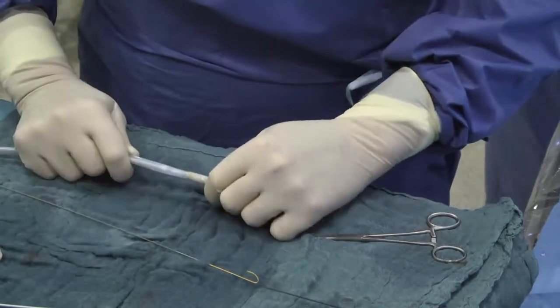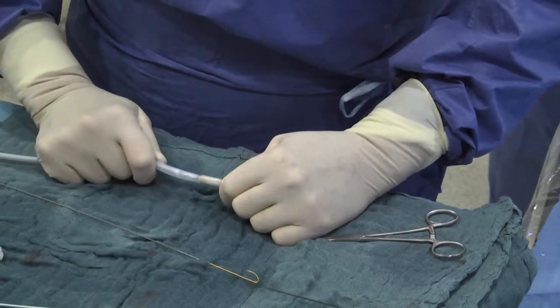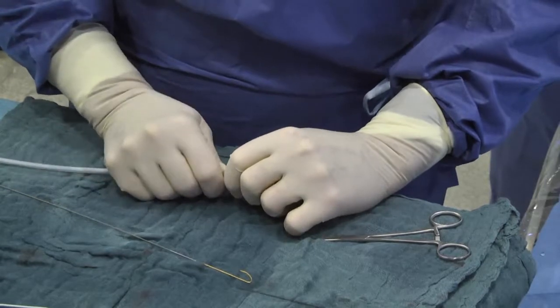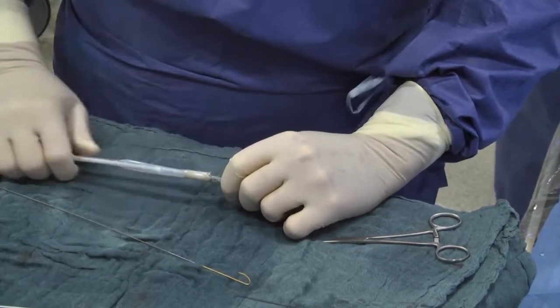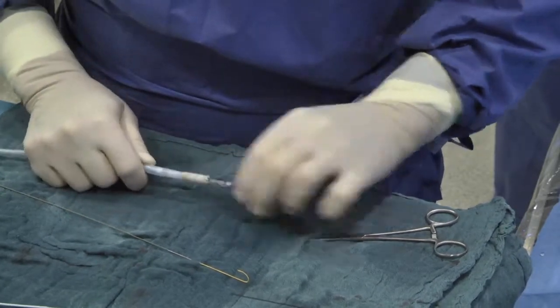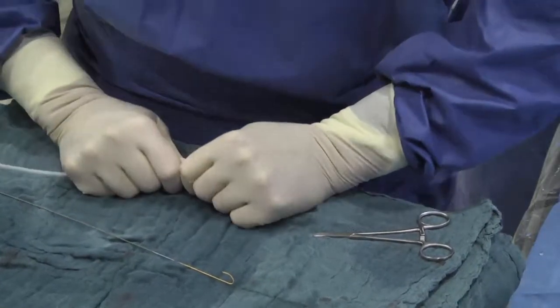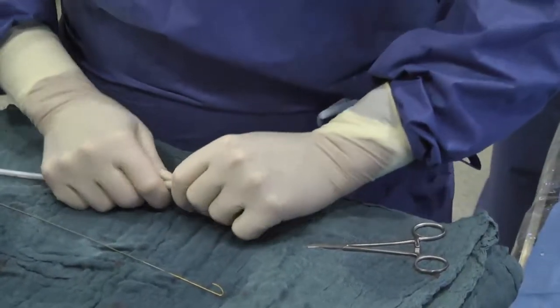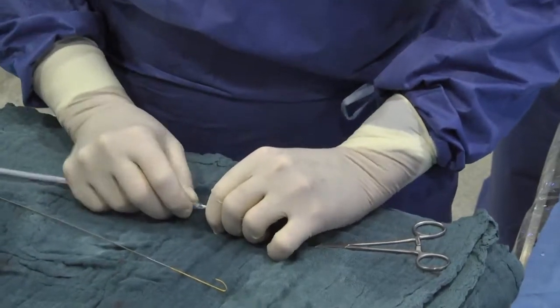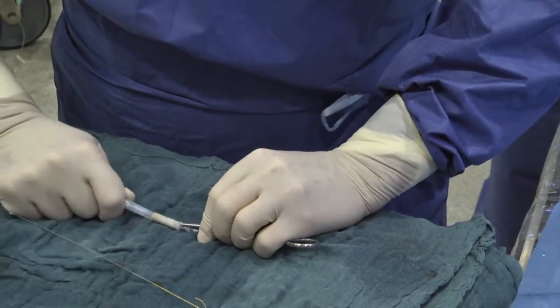Uncovering the valve, even in a curved situation, is easy. Not easy. It takes some strength. No, it's not easy. Especially, we had problems to uncover the valve, but it always worked. But it was difficult in cases. So I have some trouble with going with the covering over without moving the valve. So I'm trying to push it.